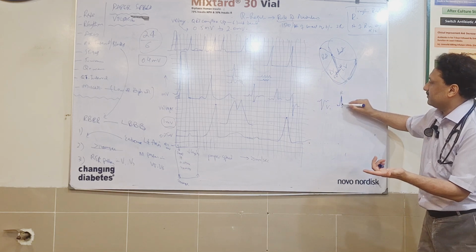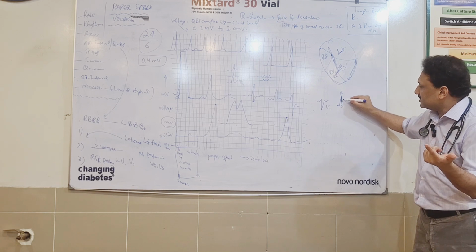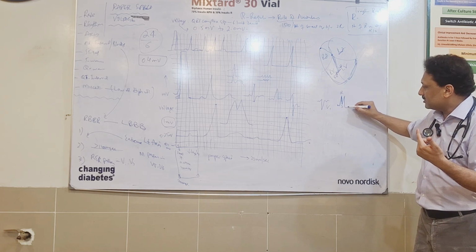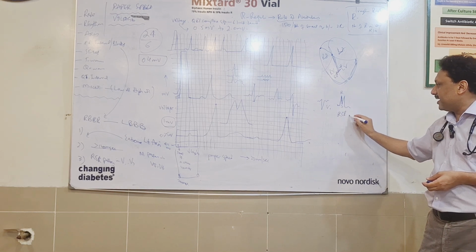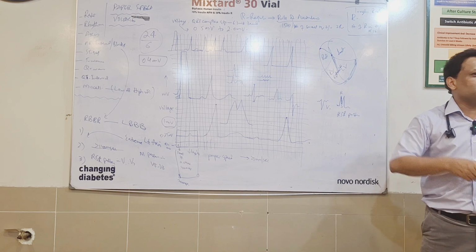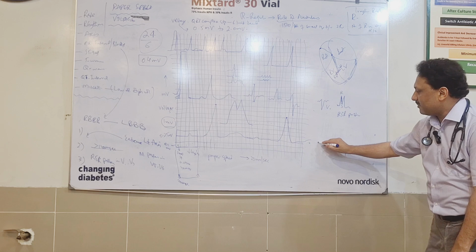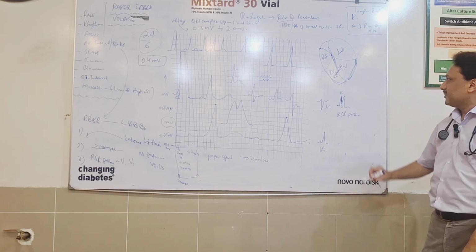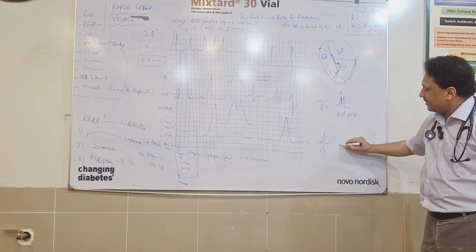Again there is a contraction, and as ventricular depolarization is there, again there is a waveform, another wave. And then that will settle down again. So what happened here? There is an RSR pattern seen in leads V1 and V2. The same thing goes in left bundle branch block. Like in a left bundle block patient, I make, say, a lead, this is lead V5. Now the current is not going to the left side. What will happen?